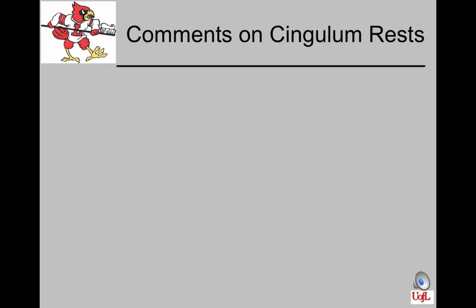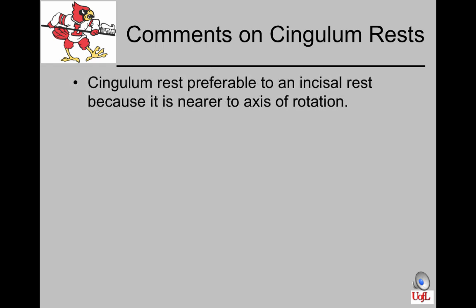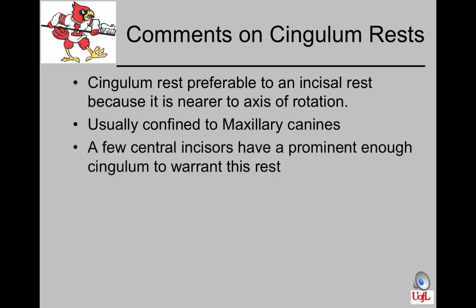To summarize the cingulum rest, cingulum rests are preferable to incisal rests because they are nearer to the axis of rotation, exerting less force on the tooth. Usually they're confined to the maxillary canines, but there are a few central incisors that have a prominent enough cingulum to warrant placement of the rest.